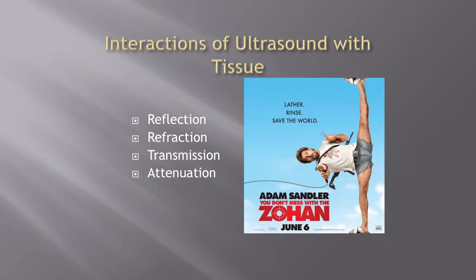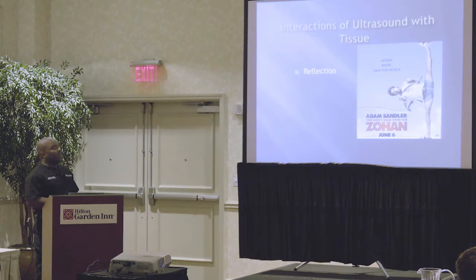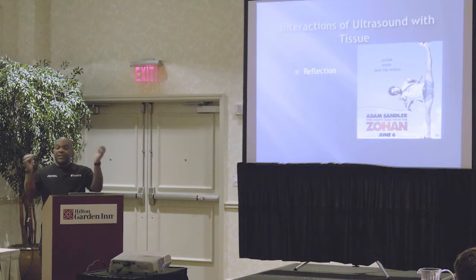All right, and now, going back to that grocery store, as you walk towards the grocery store, there are going to be things that get in your way. It's going to affect how quickly you get to the grocery store and how tired you are when you get there, because you have to walk back. Same thing with the sound wave. As you're sending the sound wave out, there are going to be a lot of things that affect it before it even gets to the organ, and that's going to determine how good your image looks when it's coming back. One of those things is called reflection, all right? As the sound wave goes through the tissue, some of the sound wave is going to be reflected away, all right? And there's nothing one can do about that.